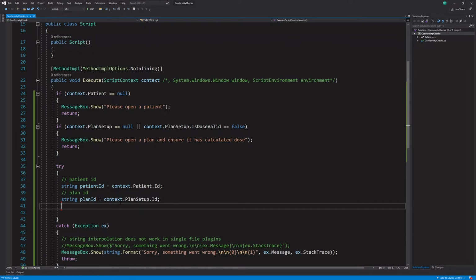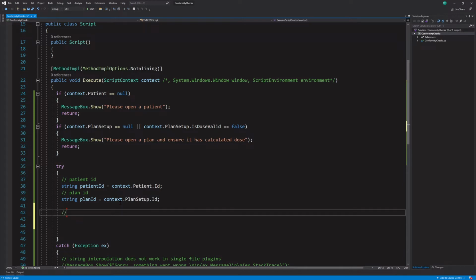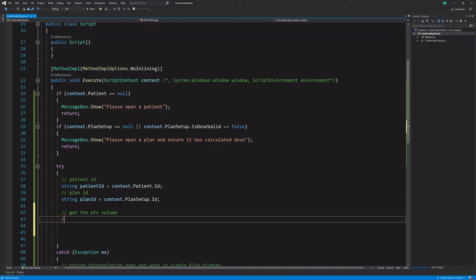So we need a few things. We need to get the PTV, because we need the PTV volume. So we need to get the PTV volume, and we need the dose at 50% RX. RX is short for prescription, if you're not familiar with treatment planning.